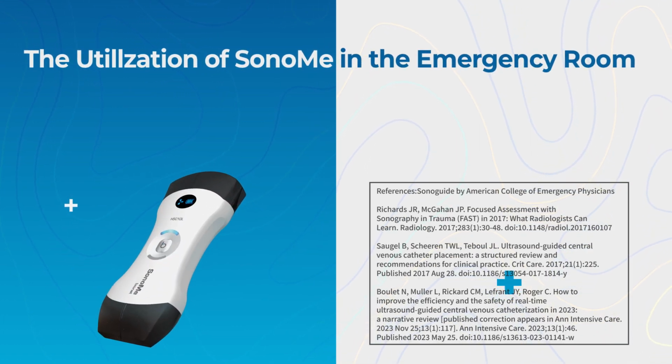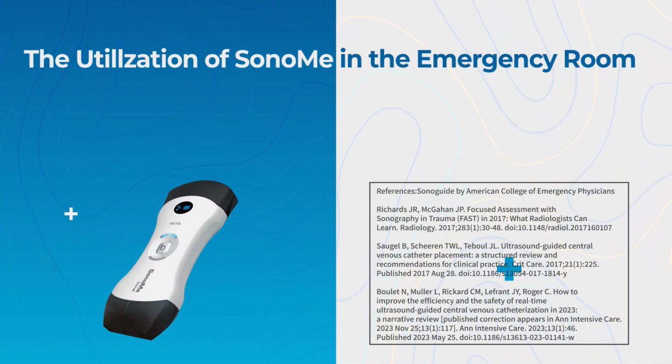In this video titled, The Utilization of SonoMe in the Emergency Room, we will explore the practical application of SonoMe in urgent medical situations, showcasing its efficacy for efficient and timely diagnosis.